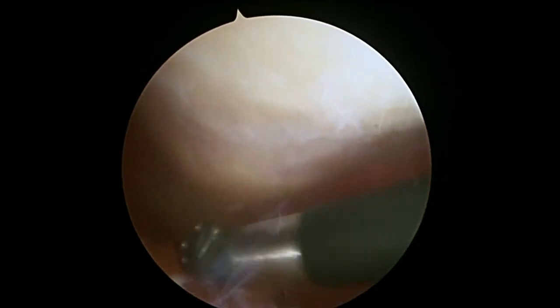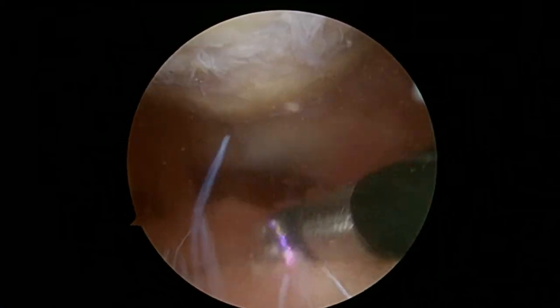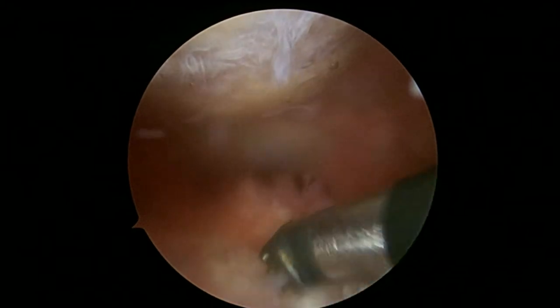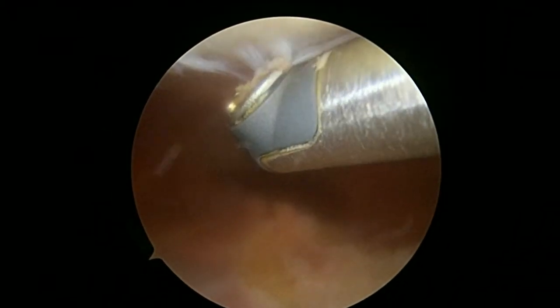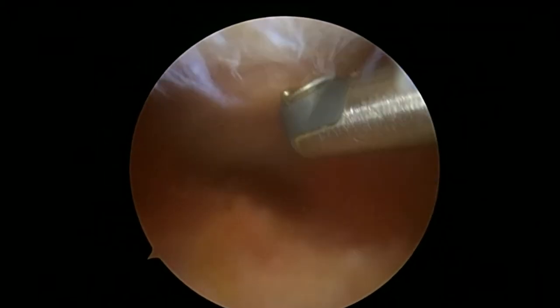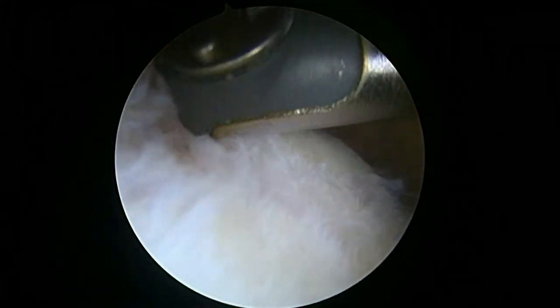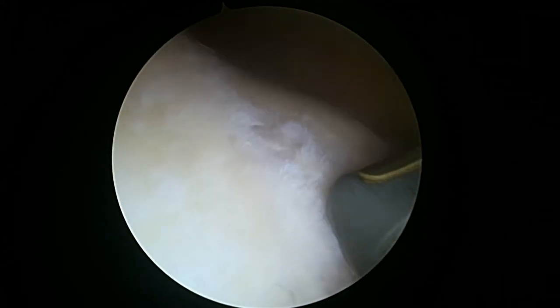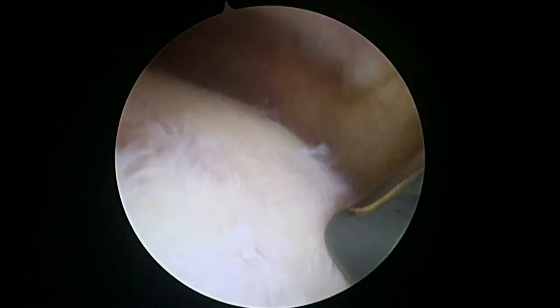Okay, so this is your patella at the top of the screen. And unfortunately, you've got a lot of arthritis here also. You're missing a lot of cartilage. As we look up here at the top of the screen, as we pull back, we'll get a better look. So here's the patella at the top of the screen. We can see the trochlea where the patella is supposed to have a nice, smooth, gliding surface. It's pretty rough and irregular, too.